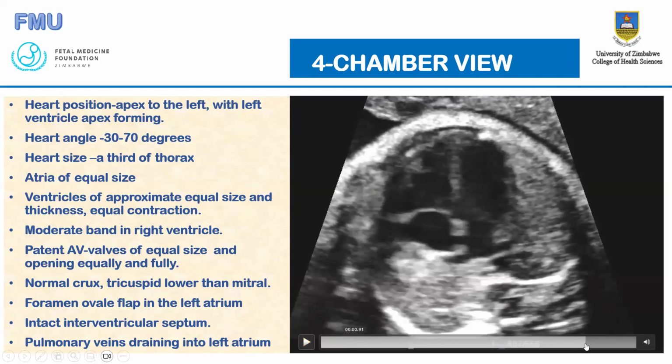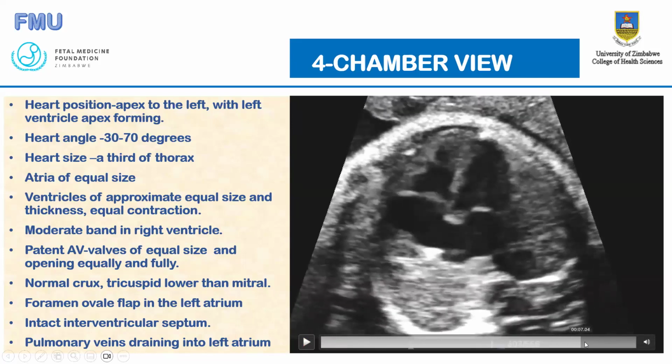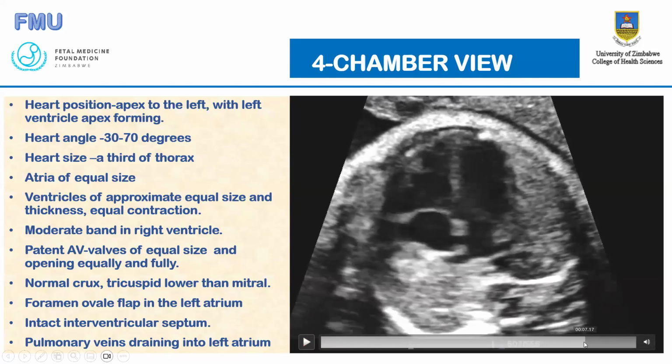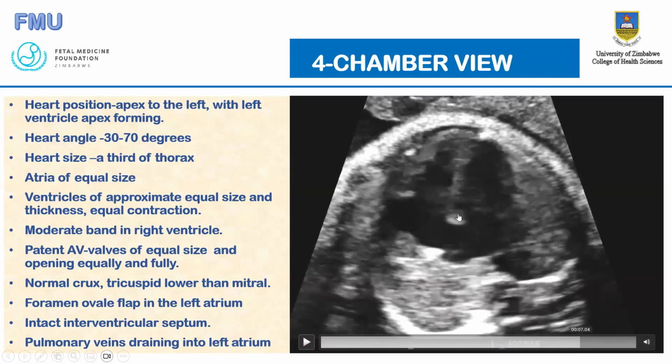So if you are to play it slowly, you can see the frame rate here was not the highest you can get. You can get it better than this. You can see how we are struggling to just demonstrate. Yeah, there we are. So these ventricle valves are opened now.